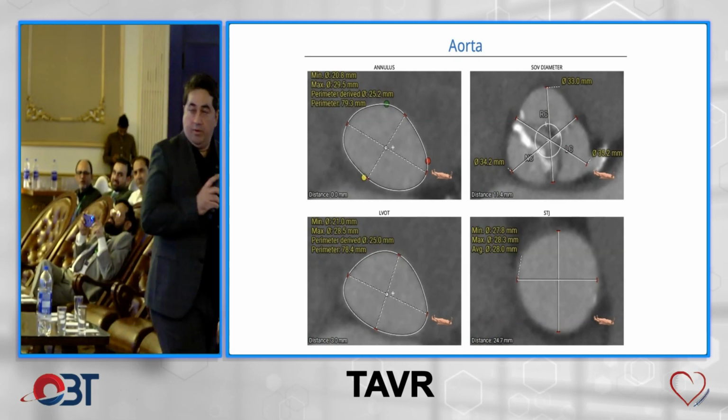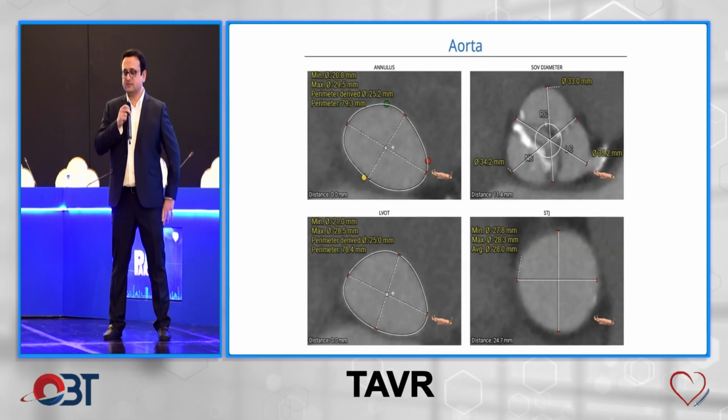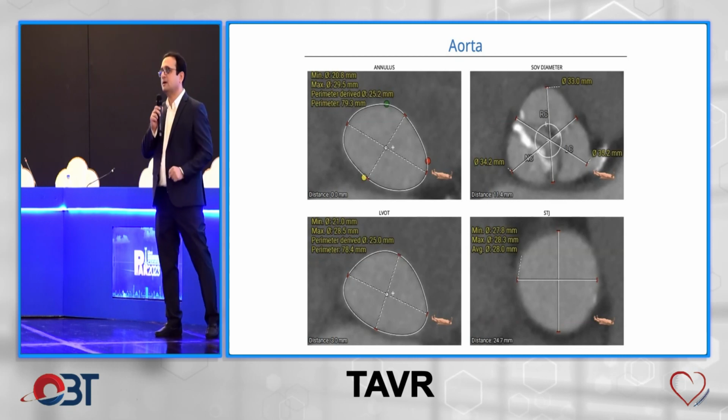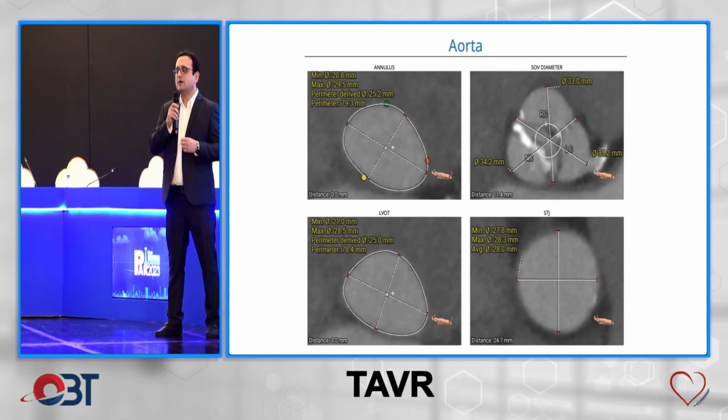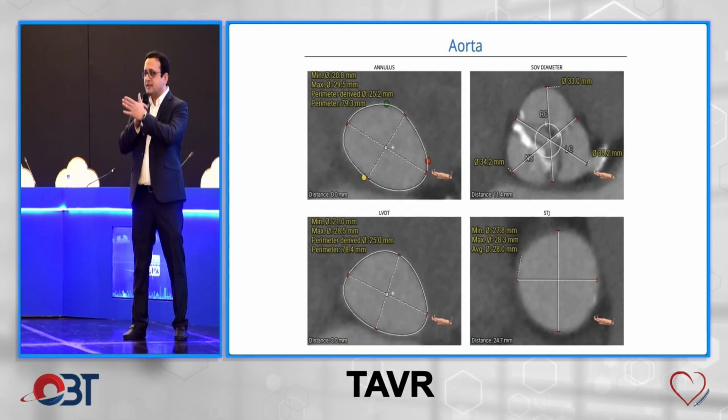Okay, a couple of things. For bicuspid valves, remember that all the standard measurements you learn on courses, for sinuses, for coronary heights and so on, are for tri-leaflet valves. A bicuspid valve has two leaflets doing the work of three, so they are bigger in size. Also, the flow turbulence in them is higher compared to a tri-leaflet valve, because they open more forcefully, they're heavier, and so the calcification is also mostly heavier than what you usually see.